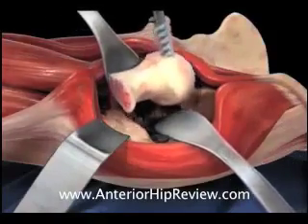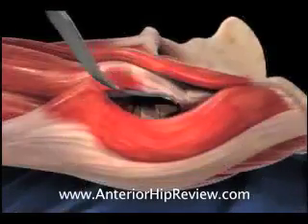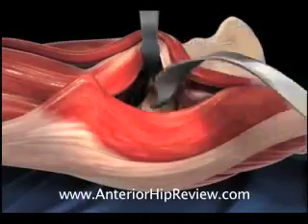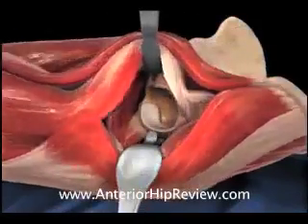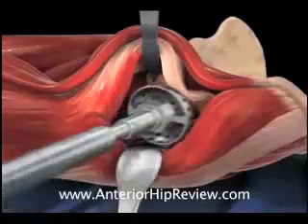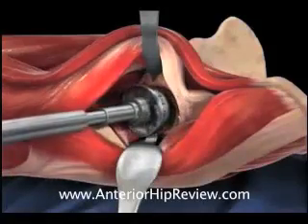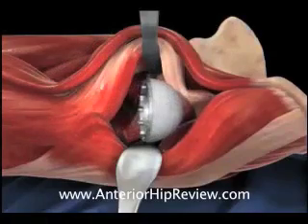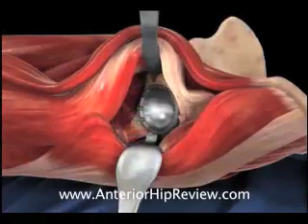Soft tissue retractors are now placed about the acetabulum to facilitate acetabular exposure in preparation for acetabular reaming. An acetabular reamer is brought into the acetabular socket, and the remaining diseased osteoarthritic cartilage is removed prior to pressing in place the acetabular component, which grows solidly into the bone. A plastic bearing shell is snapped inside the acetabulum.